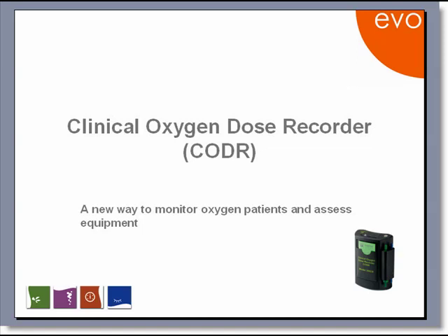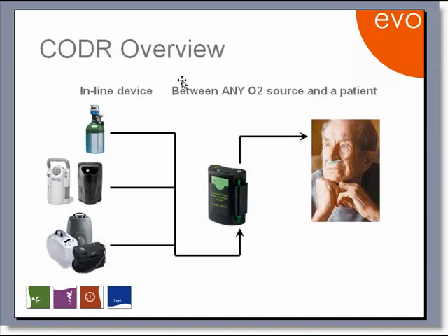Hi, and thanks for joining us for this overview of the clinical oxygen dose recorder, which we refer to as the CODR. The CODR is an inline device that goes between any oxygen source and a patient. It can be single lumen or dual lumen, or it can even be room air.